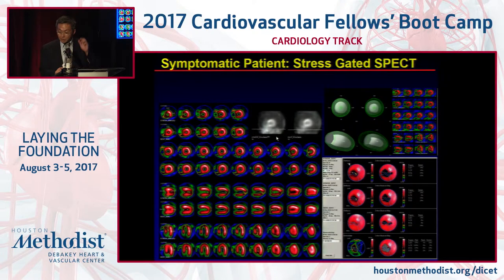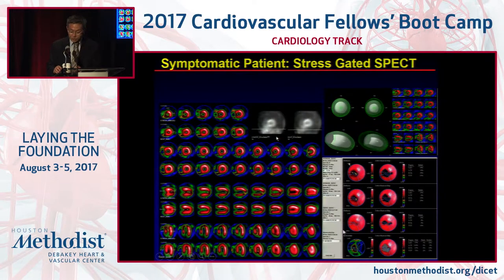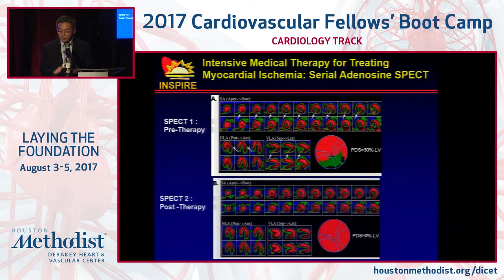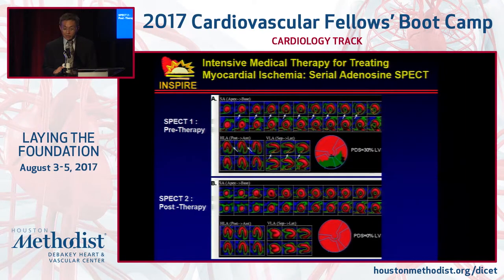This is an example of a patient with symptoms. The top part shows stress images and the bottom part shows resting images. You can see a clear defect in the anterior septal wall. Here at Methodist, we do routine quantification, which is very important for follow-up and to assess the therapeutic impact on defect size. This patient with non-ST elevation MI had an inferior wall defect with quantification, and with intensive medical therapy and revascularization, the perfusion almost completely normalized.